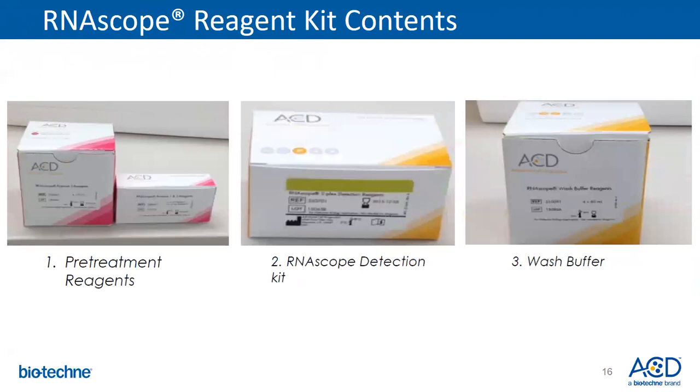This is what the stuff looks like. When you buy the RNAscope kit from us, you're going to get a bunch of pretty colored boxes. Your pre-treat reagents, that's that hydrogen peroxide I mentioned as a blocking step, your protease, and your target retrieval buffer. The target retrieval buffer comes at a 10x concentrate. So first thing we did this morning was dilute it down to 1x.